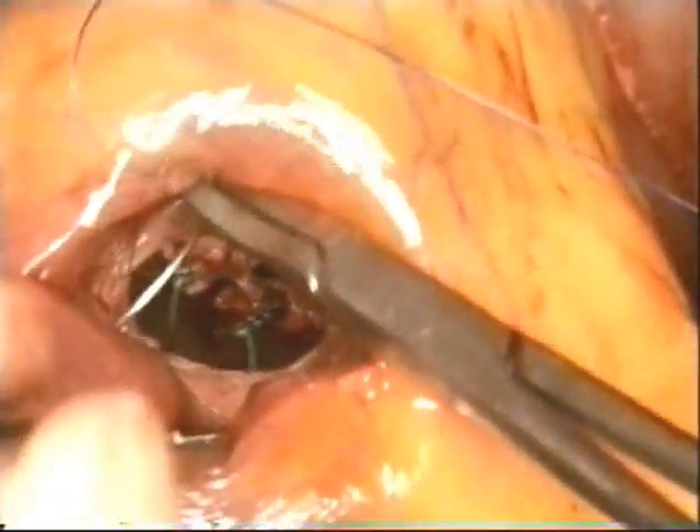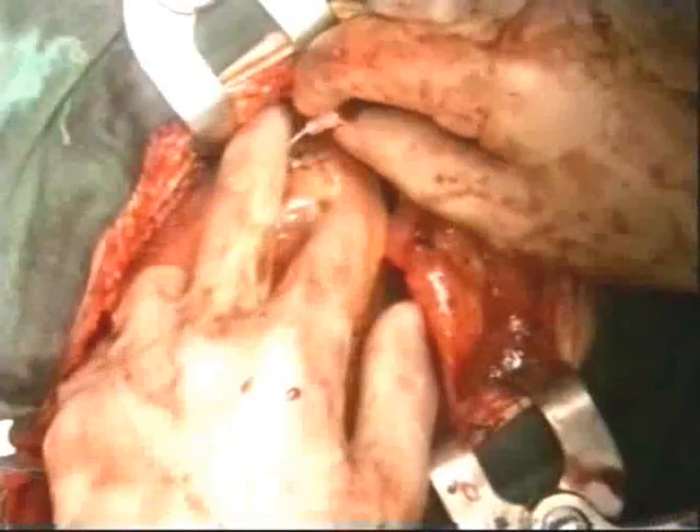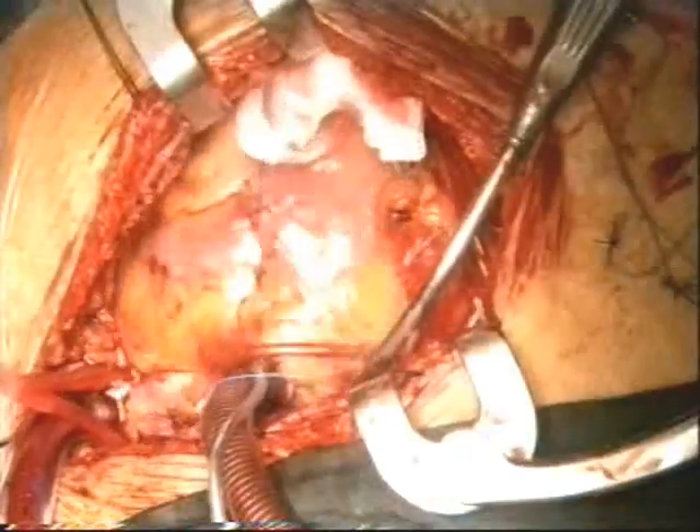These sutures are then divided, and the incision repaired with 3-O-proline sutures. The left ventricle is de-aired, and the heart re-perfused by removing the aortic cross clamp.